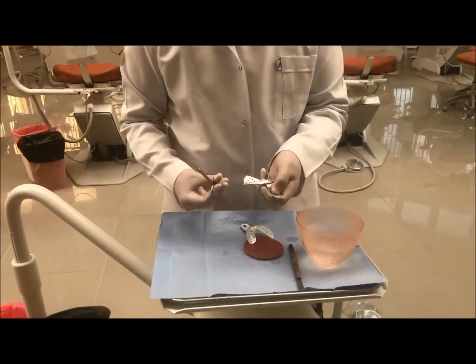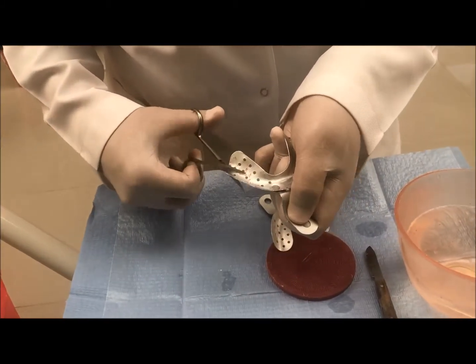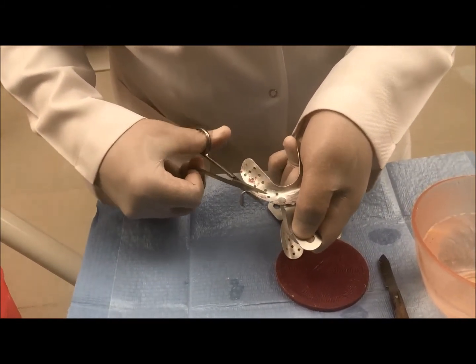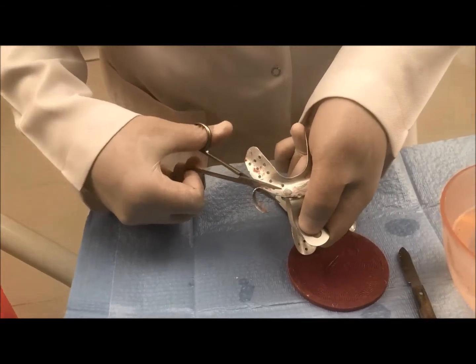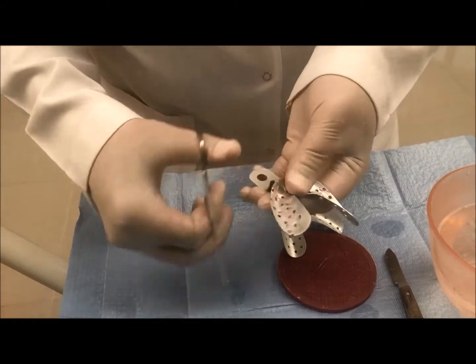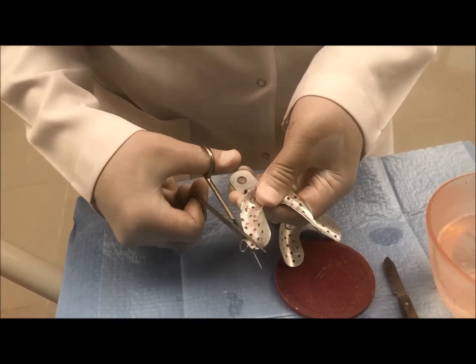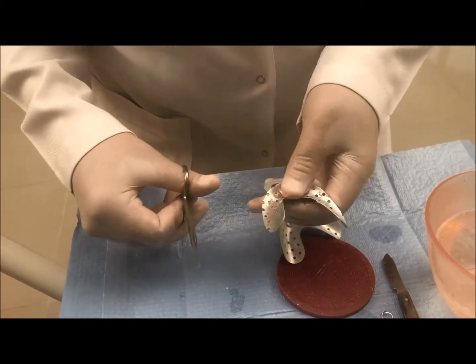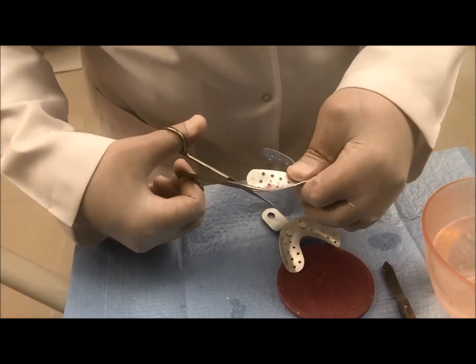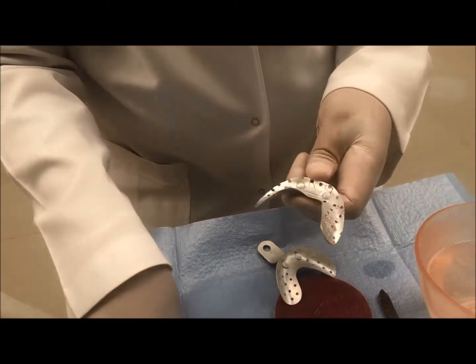I will use scissors to cut the tray at the disto-buccal area. Now I am cutting the border that is overextended — the other side by the same technique — just 2 or 3 millimeters. Be sure that the tray is not sharp at any area; if any part is sharp, cut it with the scissor.